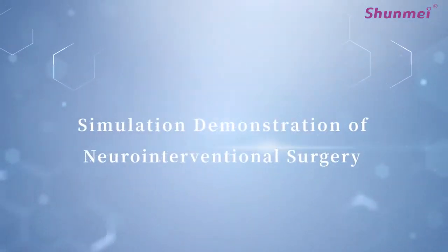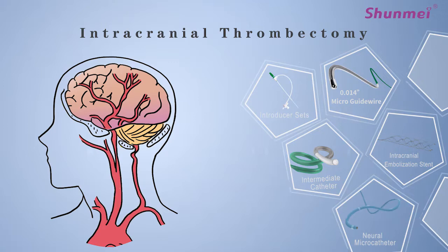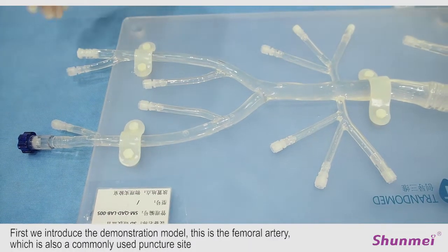Hello everyone, Shunmei Medical is here to introduce to you a procedure of neurovascular surgery and the method of using the device for intracranial thrombectomy. First, we introduce the demonstration model.